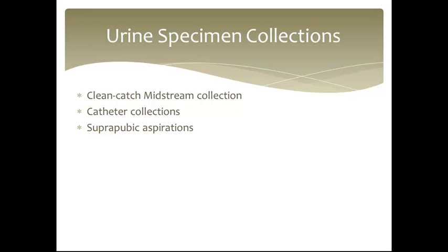And the whole purpose of getting the clean catch midstream is to evaluate whether any bacteria is present. If it's not a clean catch midstream, bacteria may be present from the outer orifices of the urinary tract. This can make it hard to determine whether bacteria was normal flora or if it is a pathogenic bacteria. We also will culture these types of specimens, and when we say cultured, we are looking and identifying microorganisms that are present.